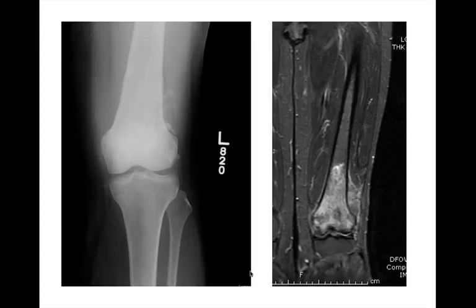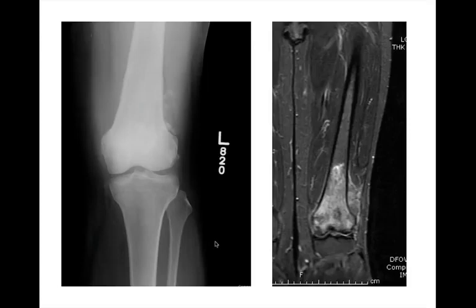Osteosarcomas love to occur around the knee — the distal femur is a favorite site. They'll be geographic lesions but will have scary features such as a wide zone of transition, cortical breakthrough, and aggressive periosteal reaction. When you see something like this, osteosarcoma is something you want to think about. The MR in this case is really just for staging to show us the extent of the tumor — we should be able to say something smart based on the radiograph alone.